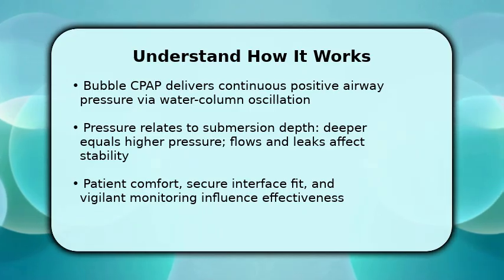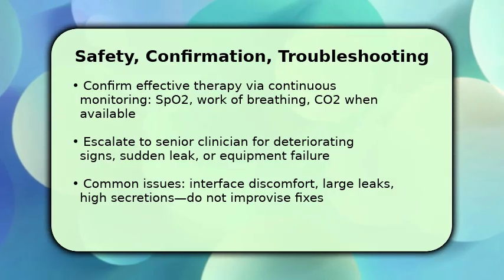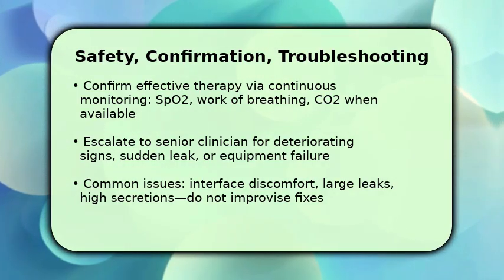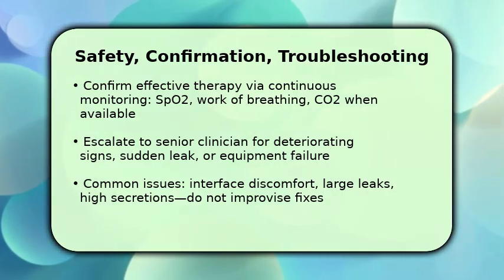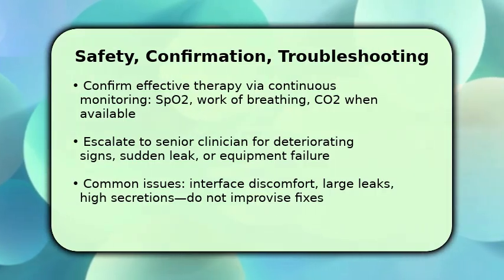To finish, prioritize safety checks and clear escalation pathways. You should know how to recognize inadequate support, rising work of breathing, desaturation, or unstable vital signs. If anything goes wrong, stop and call a qualified provider. Do not improvise fixes or bypass safety alarms.